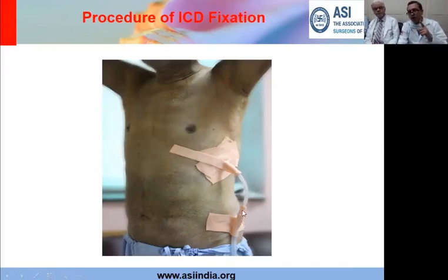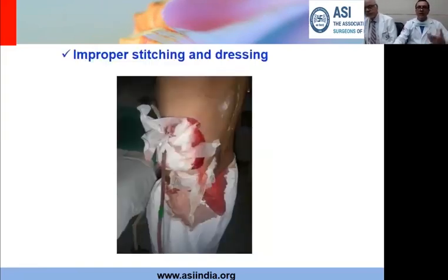And another important point, as you would see here, is that at the junction of the chest tube and the collecting bottle we put a plaster, because numerous times we've had this issue of slipping of the tube and suddenly the chest tube is lying open. So it's important to secure this junction, and then you can secure this chest tube to the side. Now if there is any pull, suppose the patient is being shifted, moving, or doing exercises, the pull will be at this point and not at the insertion point, because a pull at the insertion point causes pain to the patient apart from the possibility of inadvertent pull out. Another small but I think important point.